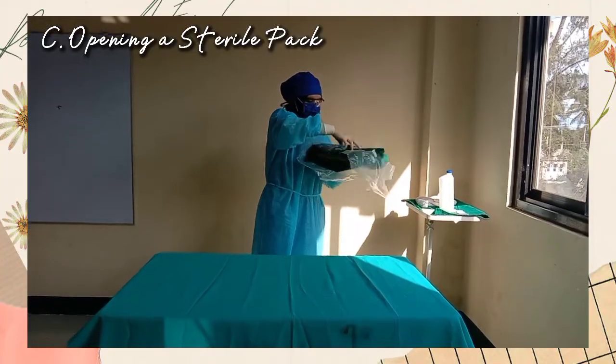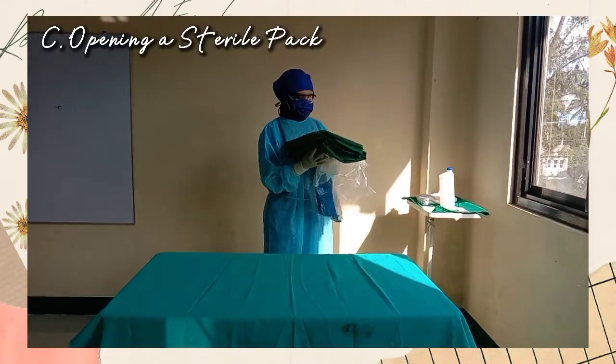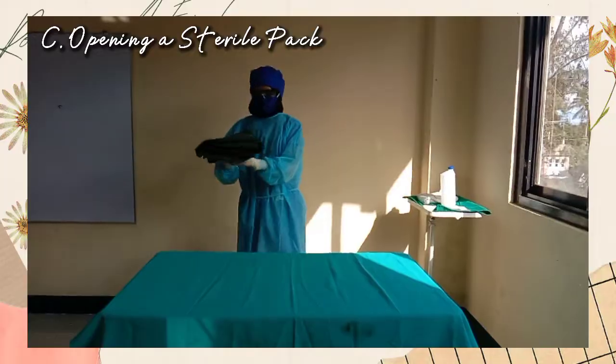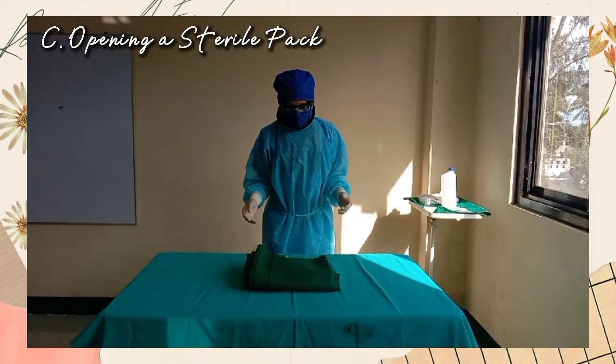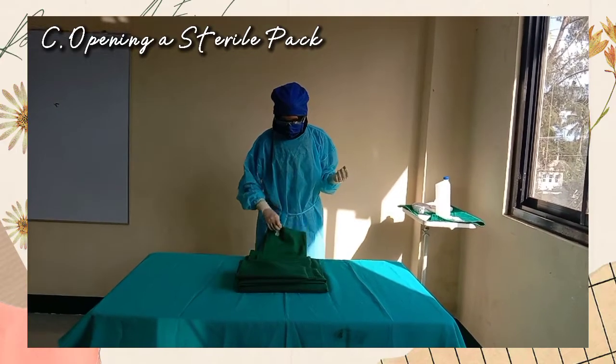Place the package in the center of the work area so that the top flap of the wrapper opens away from you, to prevent subsequent reaching directly over the exposed sterile contents, which could contaminate them. Reaching around the package, pinch the first flap on the outside of the wrapper between your thumb and index finger. With some folded packages, it may be necessary to grasp the uppermost flap at each corner. Pull the flap open, laying it flat on the far surface. Touching only the outside of the wrapper maintains the sterility of the inside part of the wrapper.